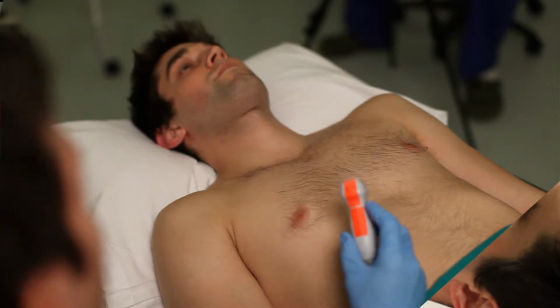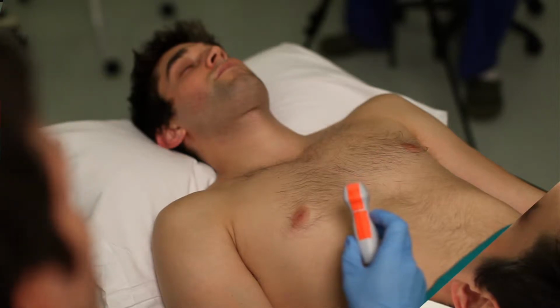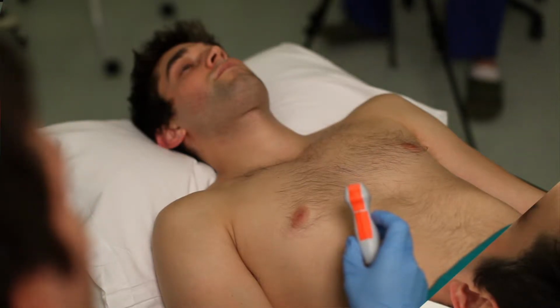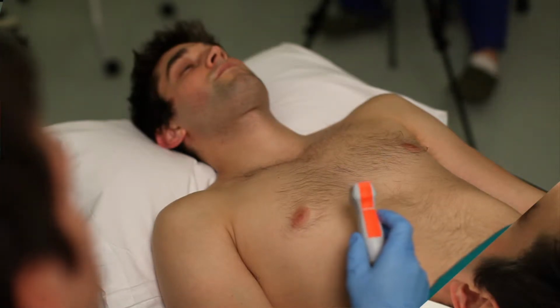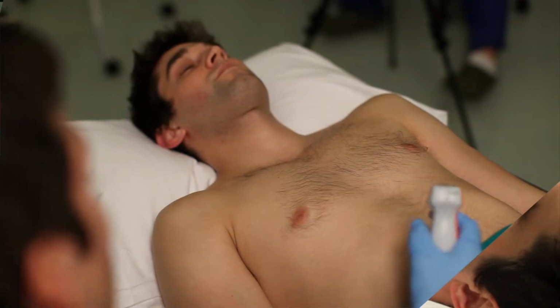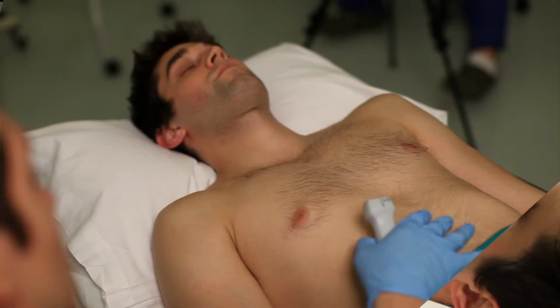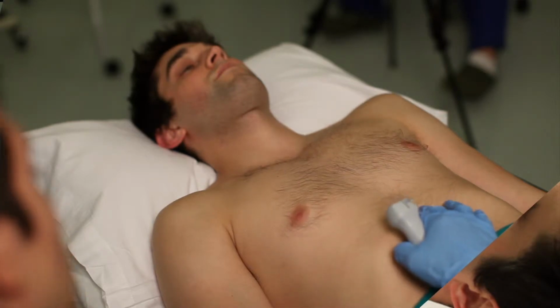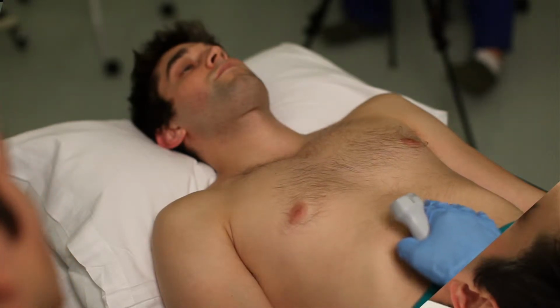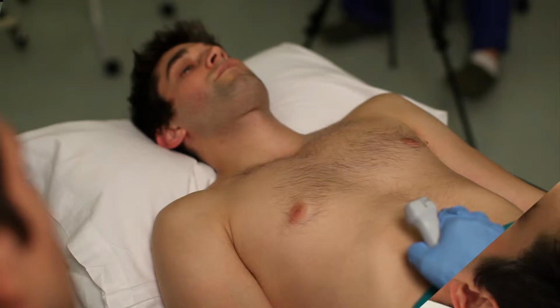Notice again that I have marked our indicator notch with orange tape so it's more easily assessed by you on video what direction and orientation the probe is in. So we're going to go ahead and use the subxyphoid window, which is approximately 2 fingers breadth down the midline below the xyphoid. You can always warn your patient that this can be a little uncomfortable. If they need to remove the tension from their abdomen, they can bend their knees.